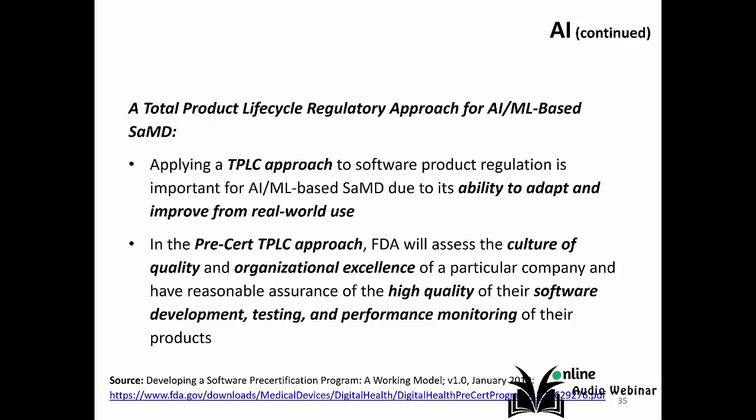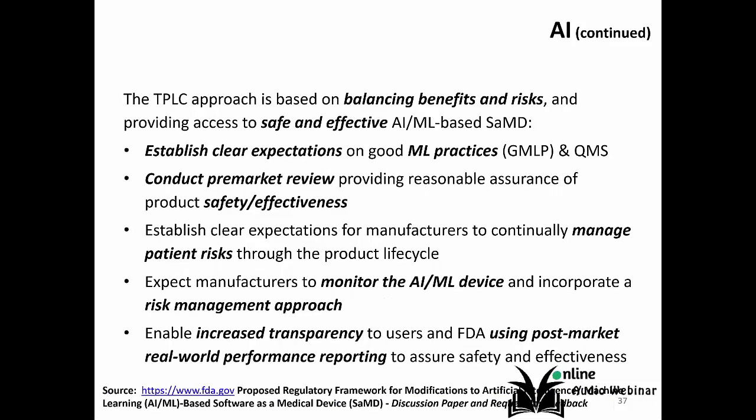The total product lifecycle regulatory approach for AI/ML-based software as a medical device can be applied to software product regulation. The TPLC approach is based on balancing benefit and risk, providing safe and effective AI/ML-based software as a medical device products.